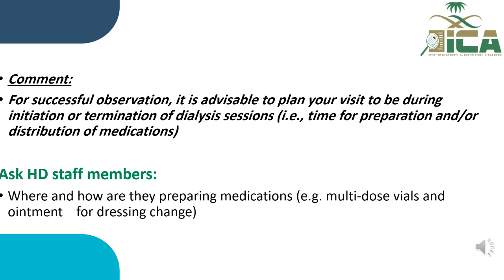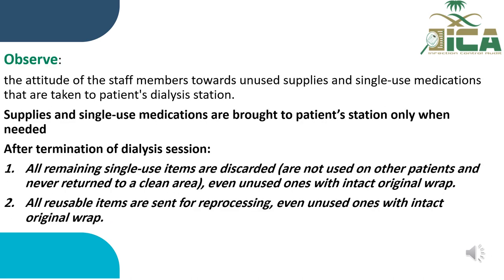For successful observations, it is advisable to plan your visits to be during initiation or termination of dialysis sessions. Ask hemodialysis staff members where and how they are preparing medication, like multi-dose vials and ointment for dressing change. Observe the attitude of staff members toward unused supplies and single-use medications that are taken to patients' dialysis stations. Supplies and single-use medications are brought to the patient station only when needed.